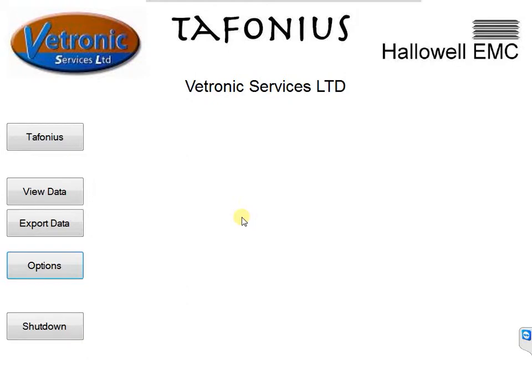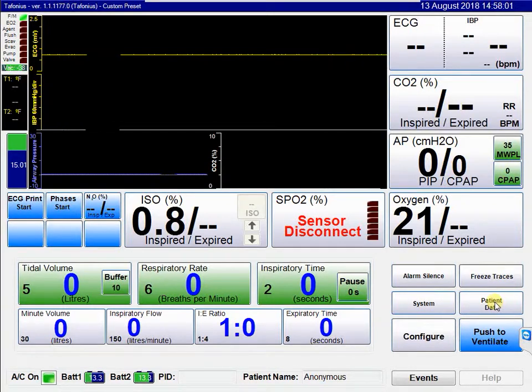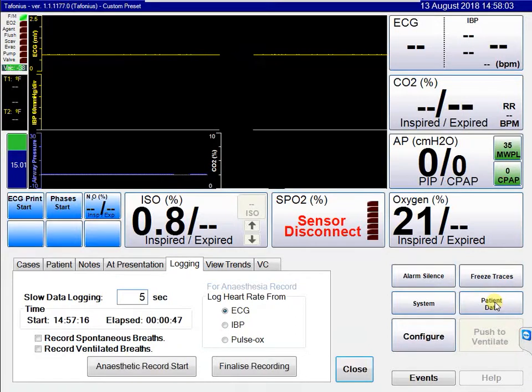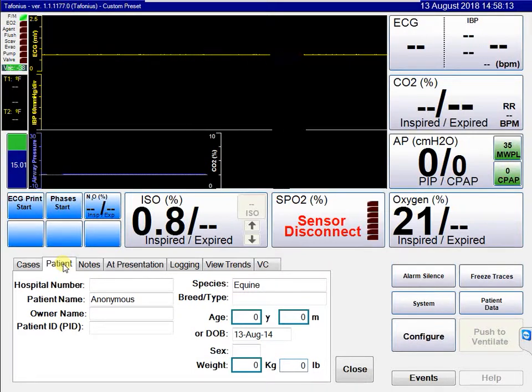The software then closes and we're back to the Tofonia screen. In the patient data button we see a number of options relating to patient information. The best place to start is with the patient tab. When you initially start recording, all the values are not filled in and the patient name is by default anonymous.